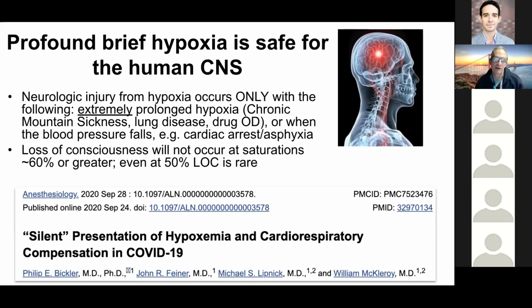So I mentioned a moment ago that pulse oximeters basically have to undergo final calibration in studies in hypoxic humans. And so we have developed techniques to create stable levels of very profound hypoxemia in subjects that have an arterial line placed to obtain blood samples. And these techniques have been used safely for a long time.